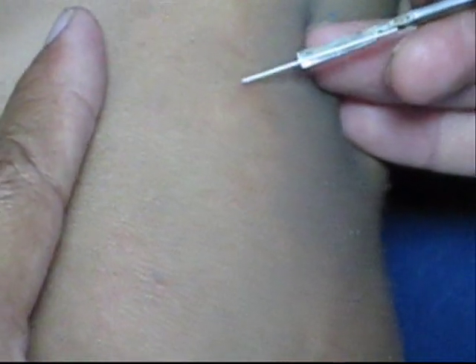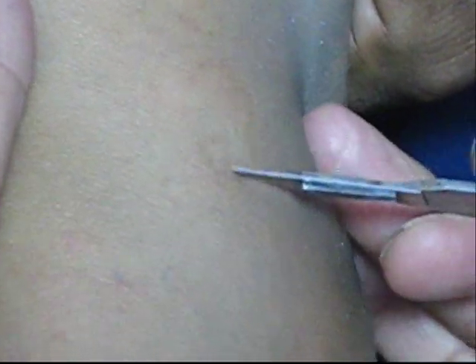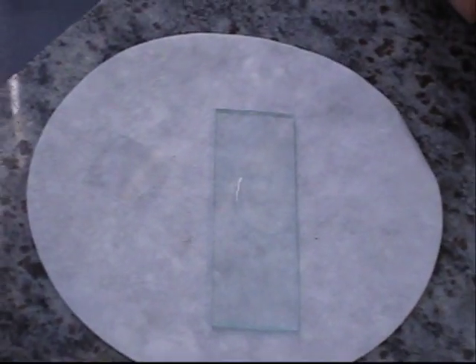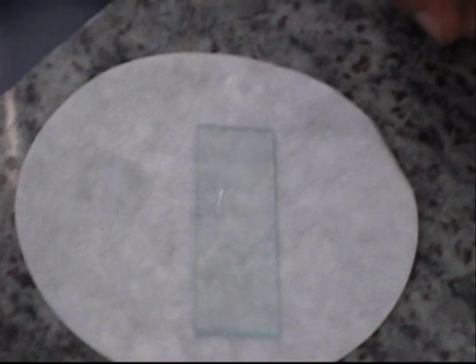We will take the scrapings from the border of the lesion, put it on a slide, add 10% KOH, and we need to wait until the tissue is dissolved. For skin, we have to wait for two to five minutes.